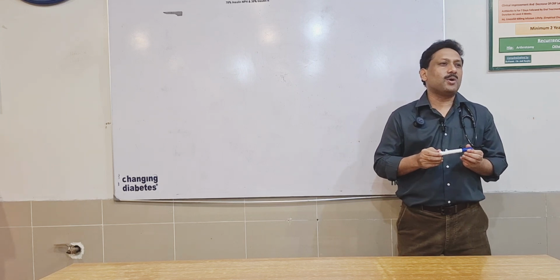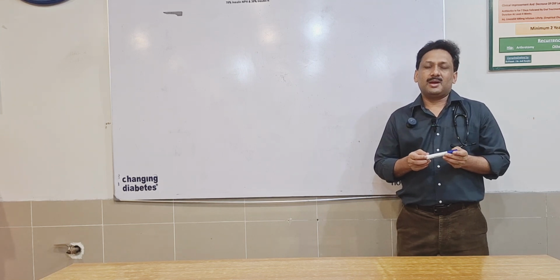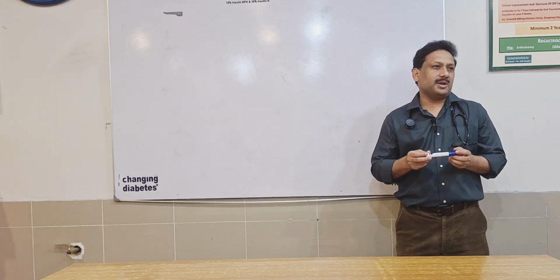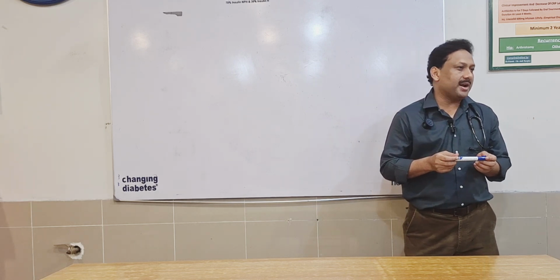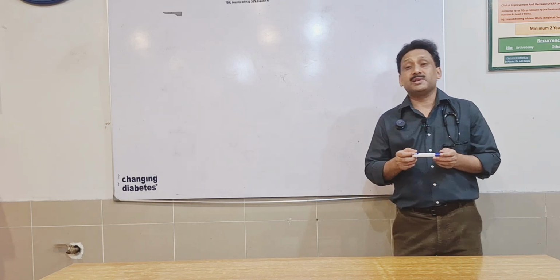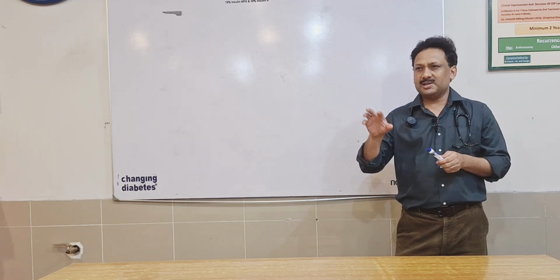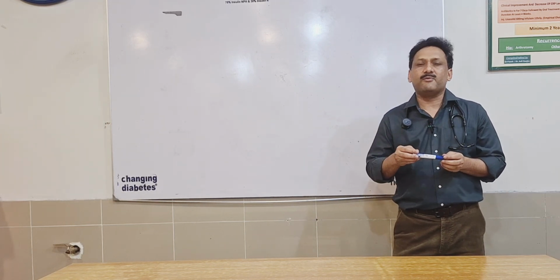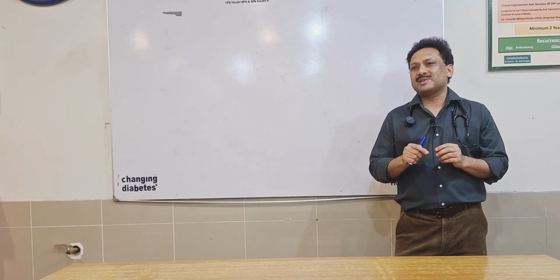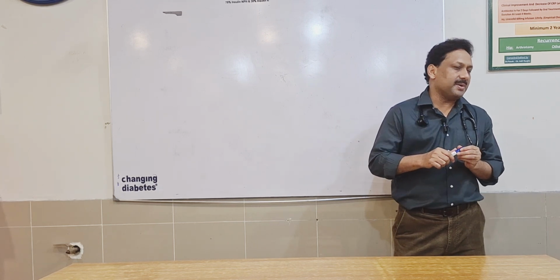Our today's session is about a very important aspect of ECG, and it relates to actually the most important cases, and I would say those cases which, if you can recognize at the right time and pick them at the right time, you can save a lot of lives. So basically, the session would be mainly revolving around the ECG segment related to ischemic heart disease.